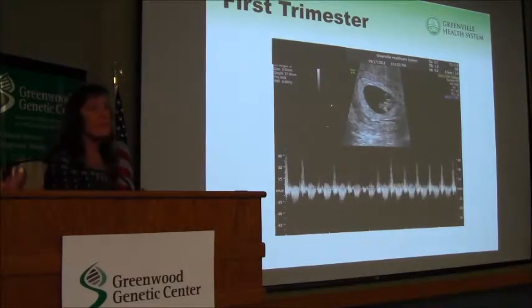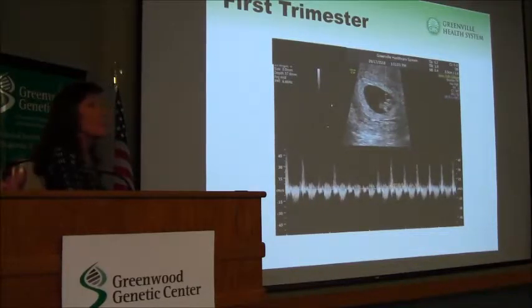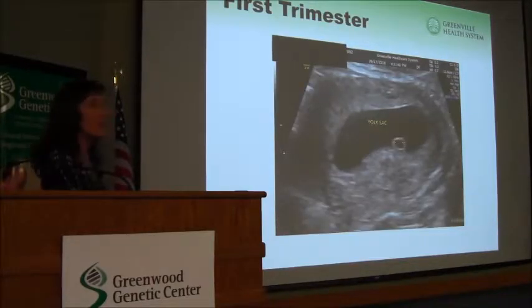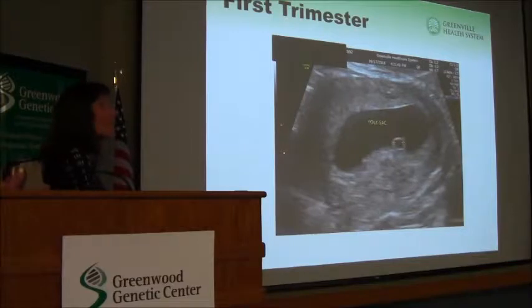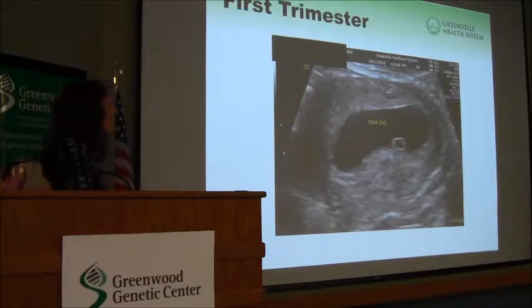So in the first trimester, the first thing we want to do is to make sure that the baby is in the uterus, so it's not an ectopic pregnancy. And then you can see at the bottom the M mode to diagnose that there is a heartbeat. So that's the first thing we do in the first trimester. And then we look at the yolk sac, which actually has genetic importance. It's not a fetal part, but a large yolk sac over 6 millimeters is associated with an increased risk for fetal aneuploidy. So in our women that are advanced maternal age or have other reasons to suspect aneuploidy, having a normal yolk sac is encouraging. We can say, hey, this is looking good. This looks like things have started well.